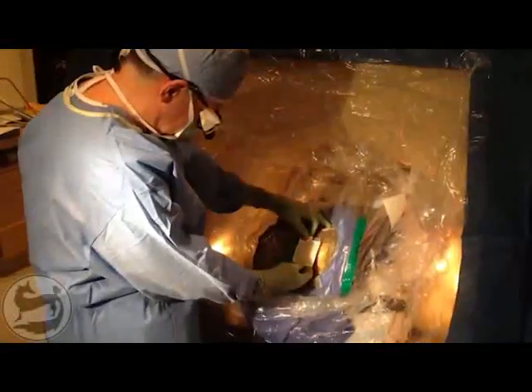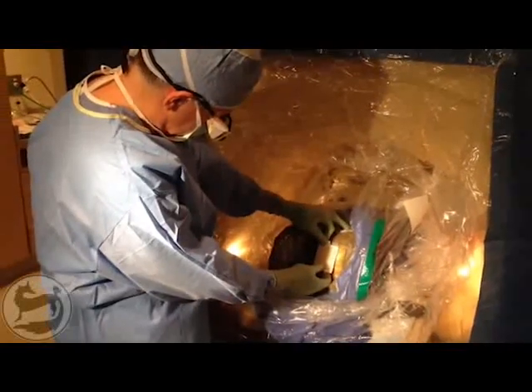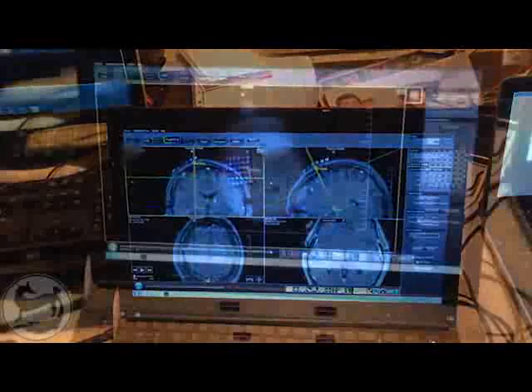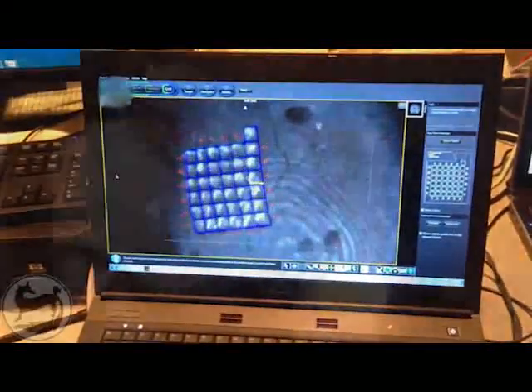A marking grid is placed in the region of the expected entry site, and the patient is moved to the magnet isocenter for a contrast-enhanced volumetric scan. Entry point and trajectory planning are performed at this time. The skull is marked with a sharp marking tool at the chosen grid position.